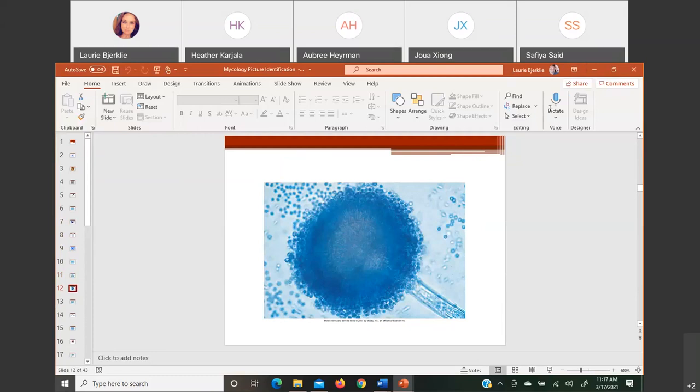Yeah, so this is Aspergillus niger. Oh, Dallas, it was a 25-year-old from an ear swab. Oh, that's fun. Not for the patient, but for us. That's interesting. The heck do they do to their ears? Well, that would make sense if they're a farmer or something. No snow is out there anymore, so they can be stirring stuff up out of the soil. Good. All right, so this was Aspergillus niger.